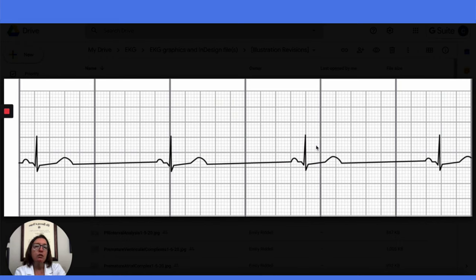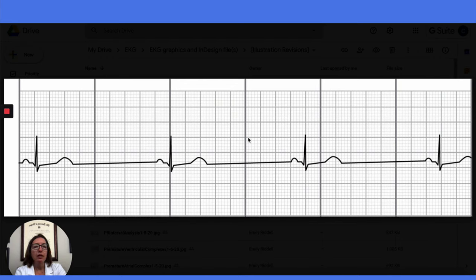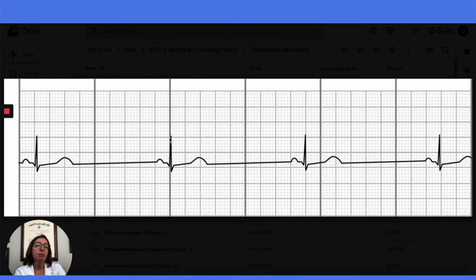Because we're dealing with a regular rhythm, we can calculate the heart rate using the small box method. So if we count the number of small boxes between the R-waves — 5, 10, 15, 20, 25, 30, 35, 40, 45 small boxes. So 1500 divided by 45 equals approximately 33 beats per minute.